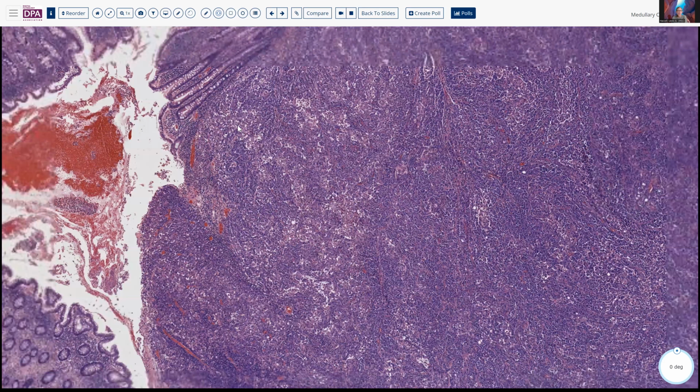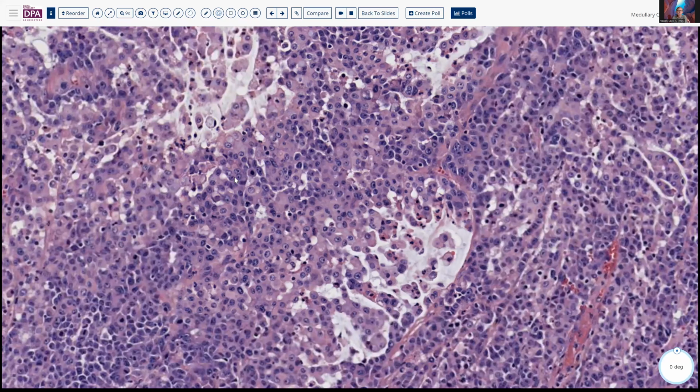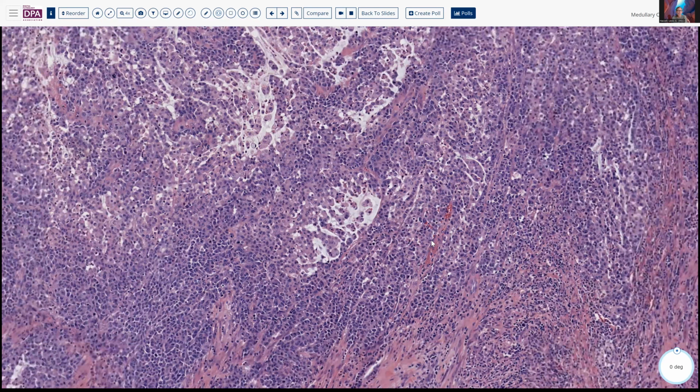But we see this associated inflammatory reaction fairly robust here at the edges of the tumor and surrounding the adjacent tumor. It extends deeply into the subjacent tissues. There's maybe a little suggestion that you have some mucin formation here associated with it. A few mucophages, as you can see here, and small clusters of cells that may be associated with mucin, or at least a mucin-like necrosis.